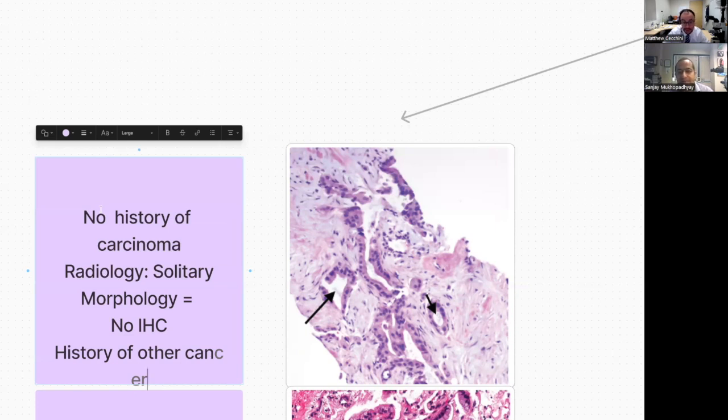Yeah, so I completely agree though. This doesn't need a lot of stains. It's completely reasonable to sign it as an adenocarcinoma. And I think we both can agree that it doesn't need a CK7, CK20, CDX2, PAX8, GATA3, Vimentin. It doesn't need a huge tray of immunostains. You're just wasting material that could be useful for the patient for targeted therapy. No, I agree. Okay, well that's a good discussion.